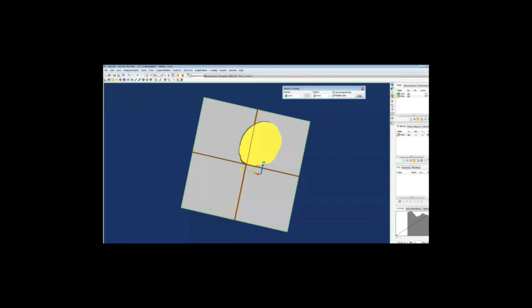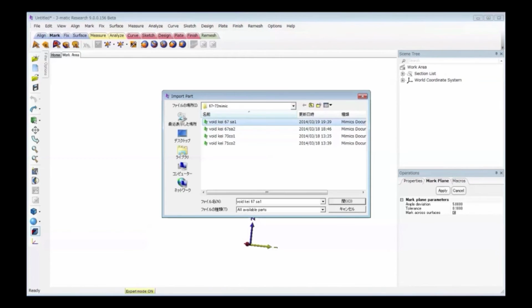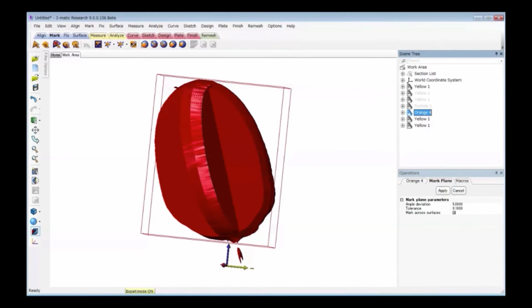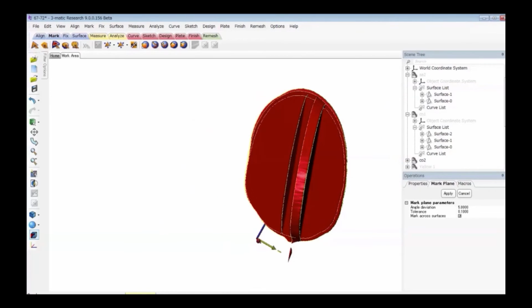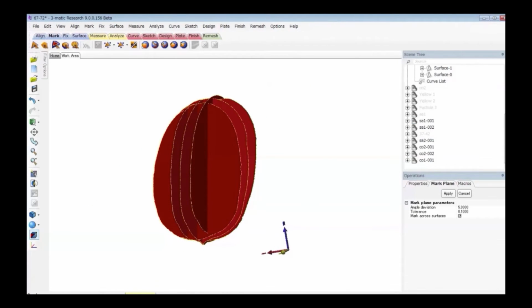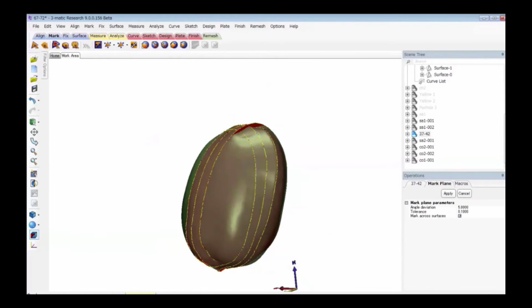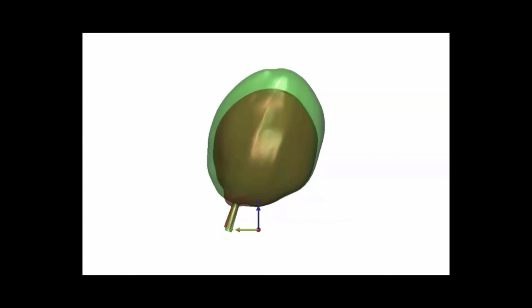MRI data were imported into software for segmentation in each phase, and then 3D data were calculated. In CAD software, slices are created as wireframes by the mark function, based on 3D data. Finally, 3D models are created by the surface construction function for filling the surface with curves.